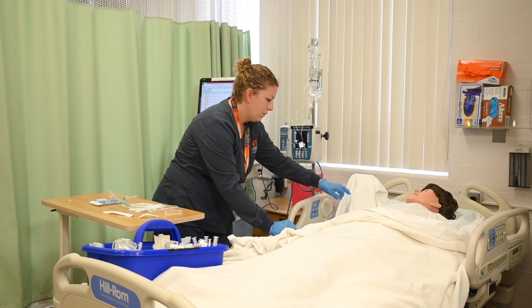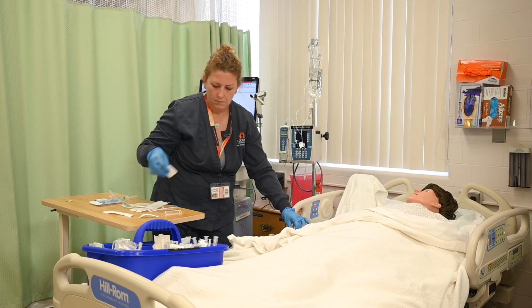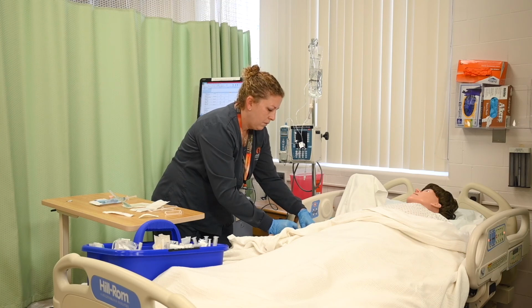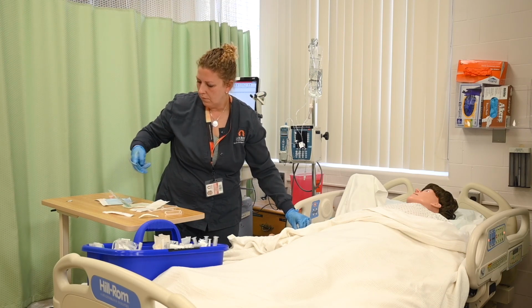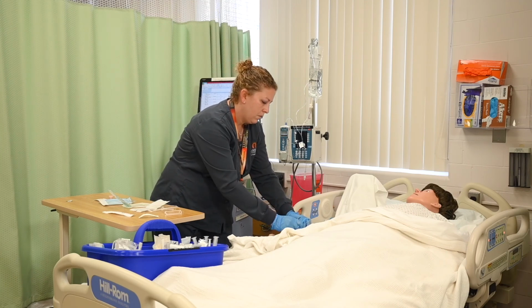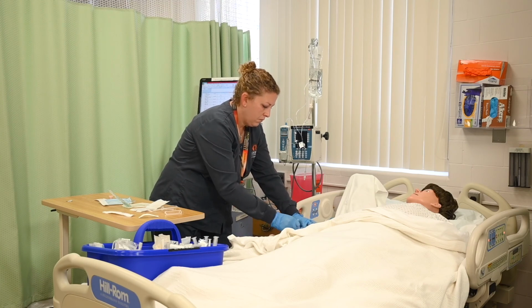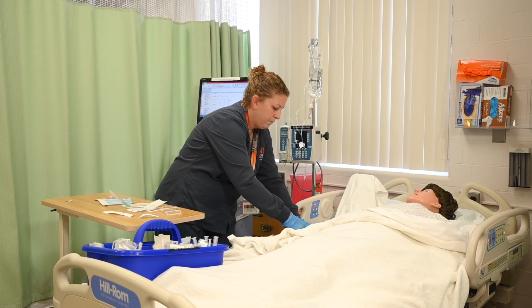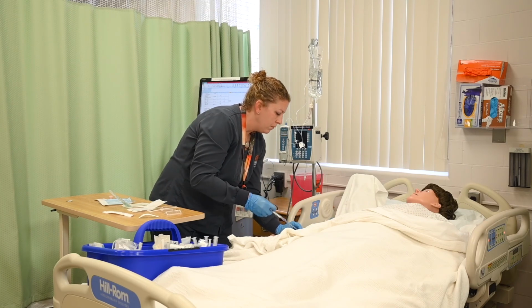Release the tourniquet. Place the 2x2 gauze under the hub of the catheter while keeping the catheter stable. Remove the cap from the extension set, INT, disconnect the sheath from the catheter, and attach the extension tubing or INT set while maintaining sterility of the connection. Do not let go of the catheter. Flush the catheter with 0.9% sodium chloride flush from the attached syringe. Watch for infiltration.